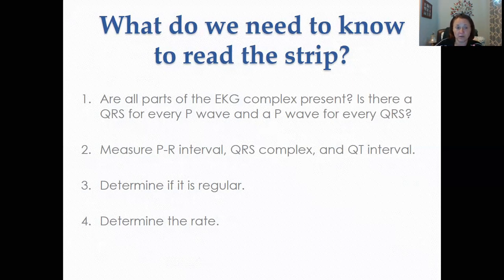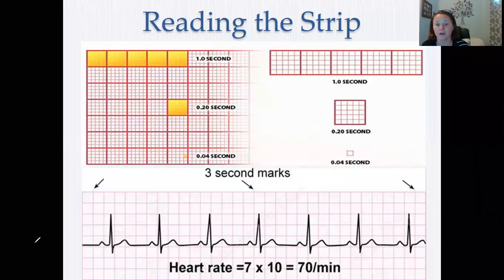And as I said, we're going to go through all this. Next up, we're going to determine if it is a regular rhythm. And lastly, we're going to determine if the rate is within normal limits. All right, so let's talk about reading these strips some more.